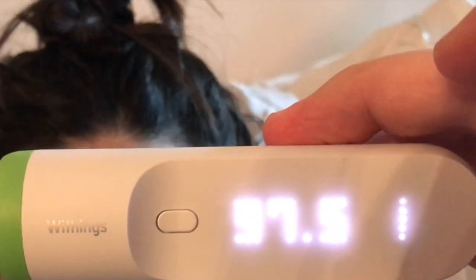So here's Tech Mama and we're going to do two measurements. One on this side: 97.5. Tech Baby knows she's next. And we'll do the same thing on this side: 97.5. So that looks consistent.